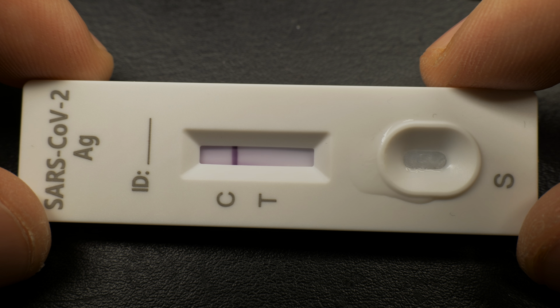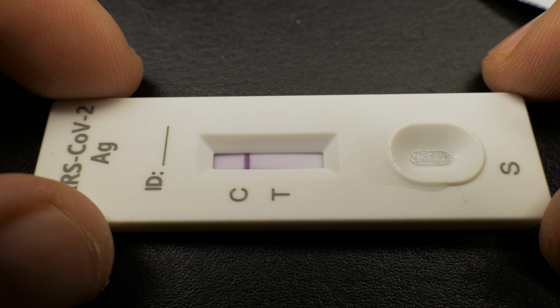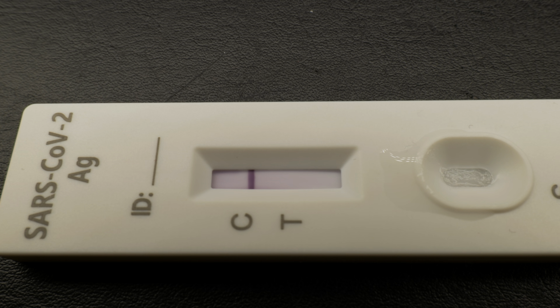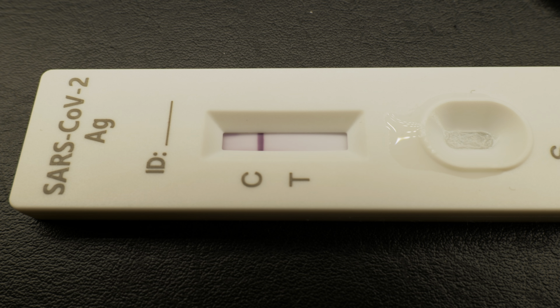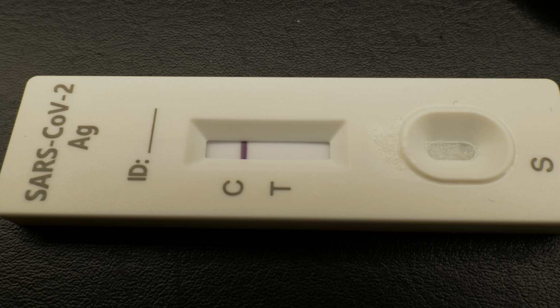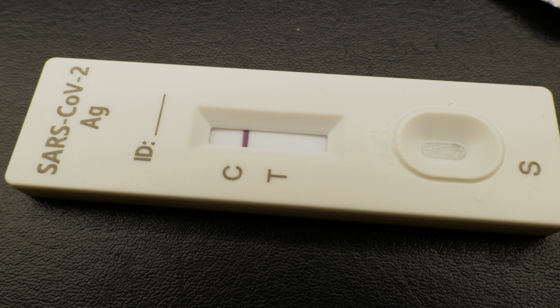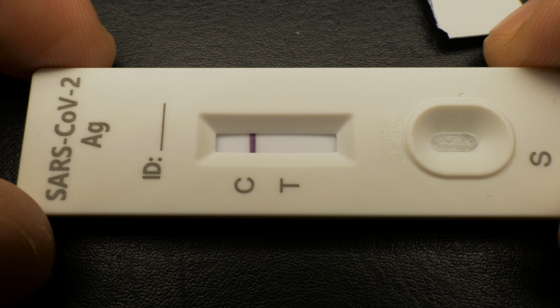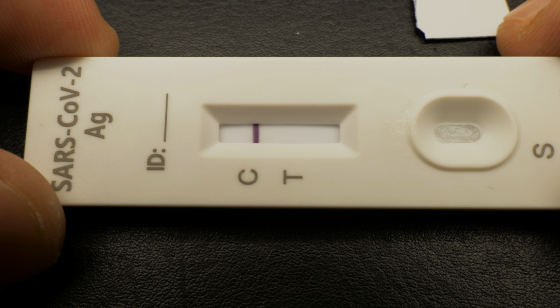This one looks pretty negative. Okay, I will wait 15 minutes. Okay, still negative. Still negative. Alright. Negative. No line, nothing.